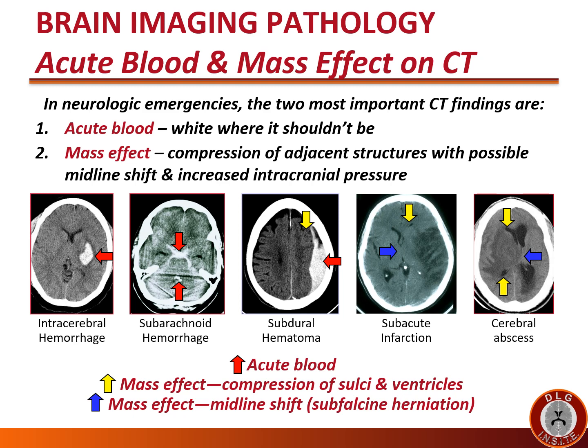Looking at the images from left to right: in the first image, the red arrow points to a ball of white in the middle of the parenchyma — this is called an intracerebral or intraparenchymal hemorrhage. In the second image, the red arrows point to white substance within CSF structures, cisterns, and fourth ventricle — this is subarachnoid hemorrhage. In the third image, the red arrow points to white outside the brain between the skull and the brain — this is a subdural hematoma — and the yellow arrow points to compression of sulci adjacent to the subdural hematoma, which is mass effect.